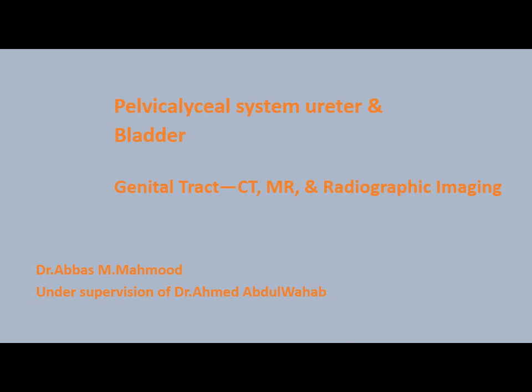Okay, good morning everyone. Today we are going to continue with our book club on the fundamentals of diagnostic radiology. Today we are going to speak about two chapters: the pelvic calyceal system, the ureter and the bladder, and the chapter on the genital tract, the CT and MRI and radiographic imaging. It will be presented by your colleague, Dr. Abbas. May he start.